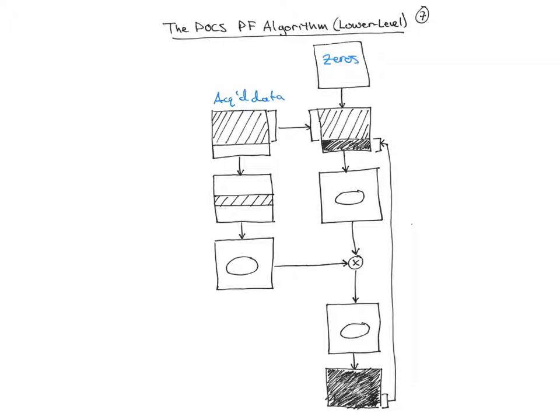We'll call that, as we have before, m sub pk of kx, ky. You replace the acquired region in your initial image with the acquired data in the first step that, as I said on the previous slide, would give you a zero-filled reconstruction.